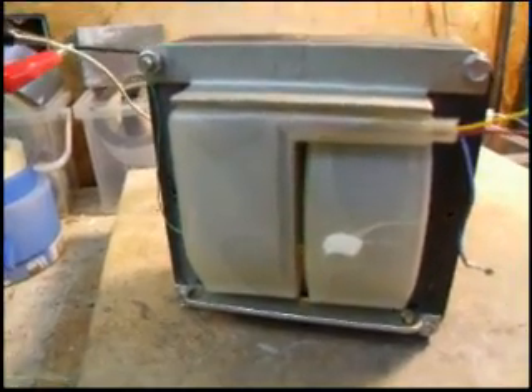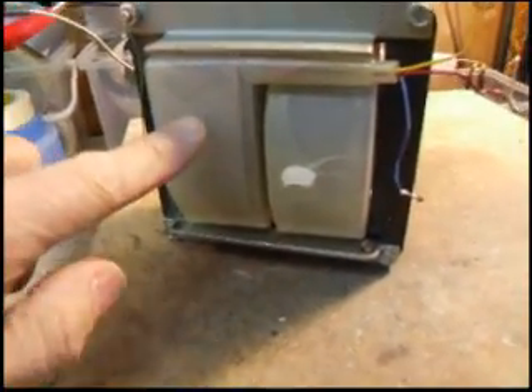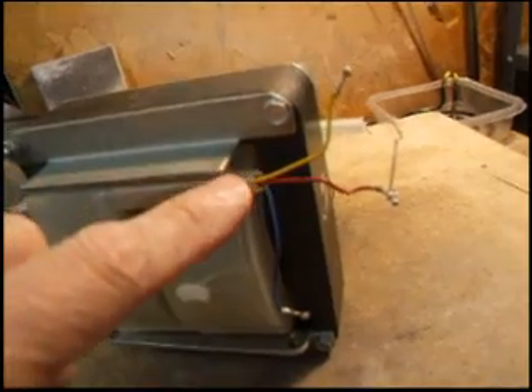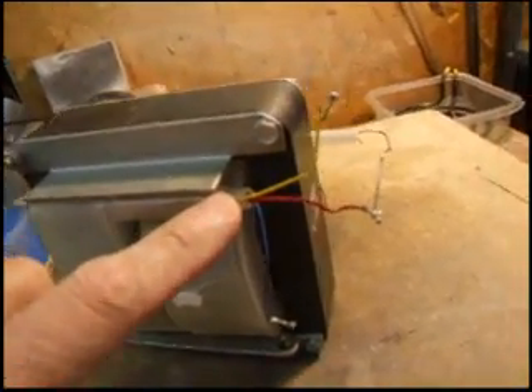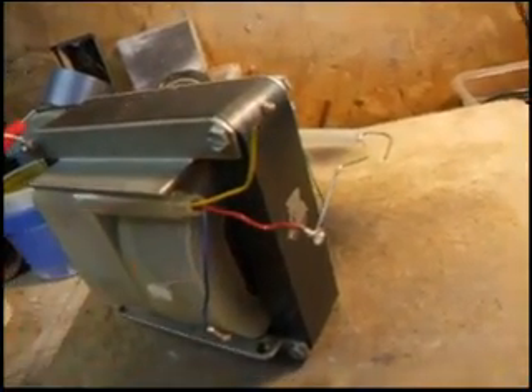One side feeds the anode of the x-ray tube and the other side feeds the cathode. The side that feeds the cathode has some extra wires on it. The blue and the yellow wire go to the filament of the tube, and the red wire goes to the grid of the tube, or the focusing cup.